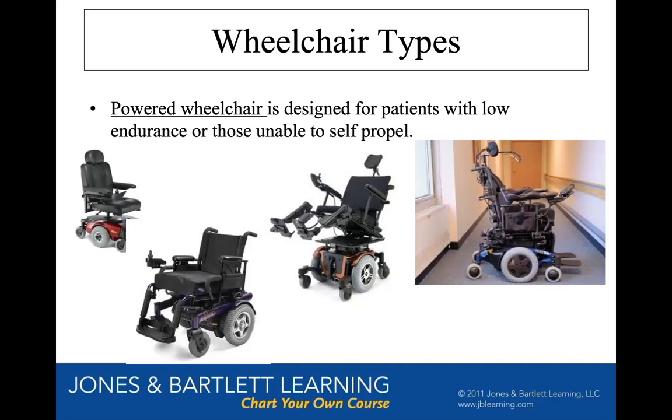There's other ways you can drive a power chair which are really cool, and I've driven these before with patients, just to get them from their room to the hallway. And I've run into walls myself and scratched up walls, but with a head array, they drive their chair with their head.